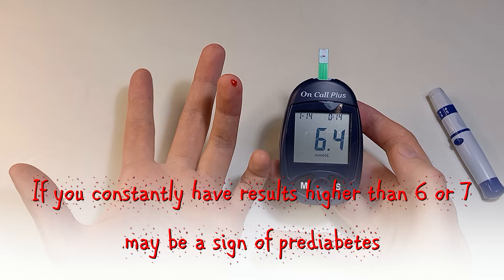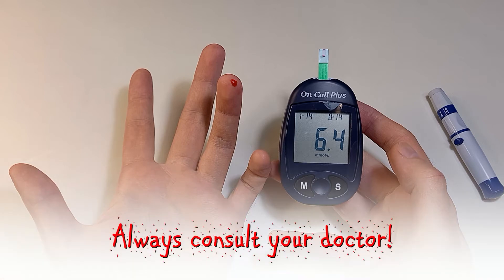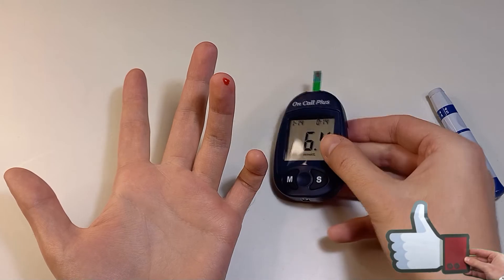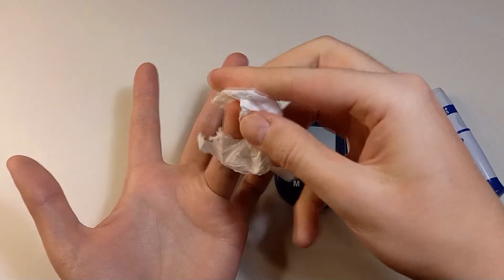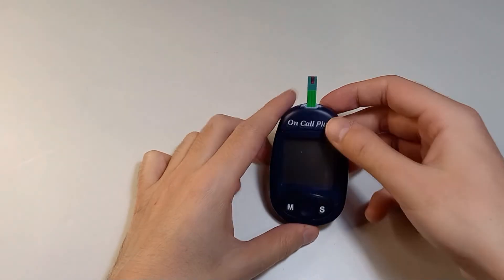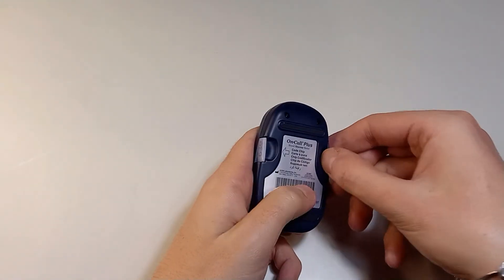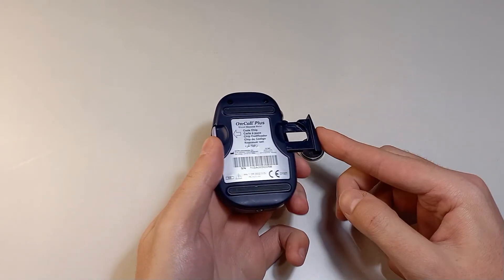If you have any of the symptoms of diabetes or if your blood sugar continues to be high, you should consult your doctor. Take a paper towel and wipe off the blood from your finger, pull out the test strip and discard it. I will remove the battery to prevent it from leaking.